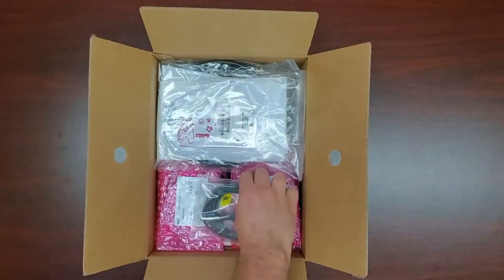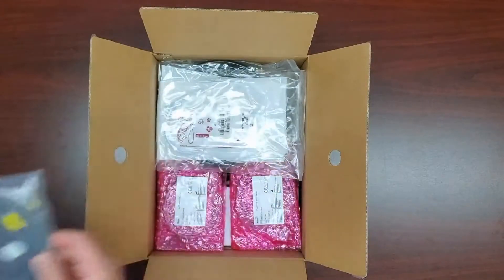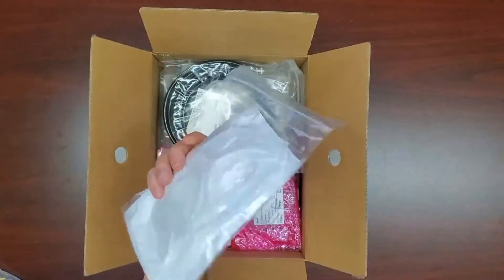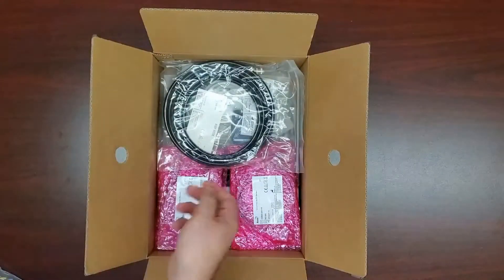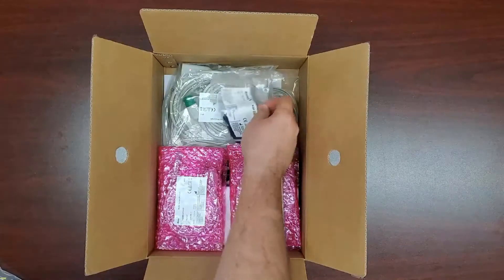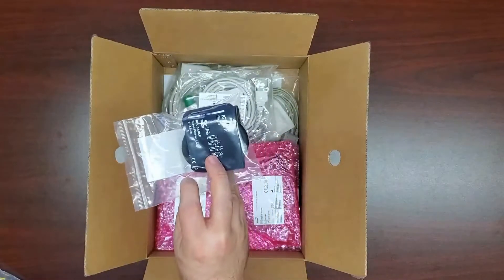The small gray cord with the silver plug is your temperature sensor. You will also find a bag with five different sizes of white disposable blood pressure cuffs. The black hose is the extension hose that will connect your cuffs to your monitor. The additional blood pressure accessory you will find is a blue reusable infant cuff.